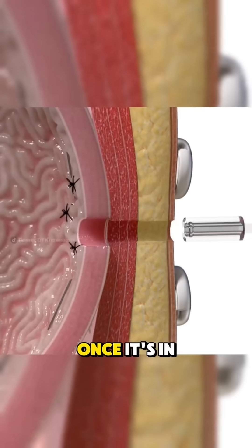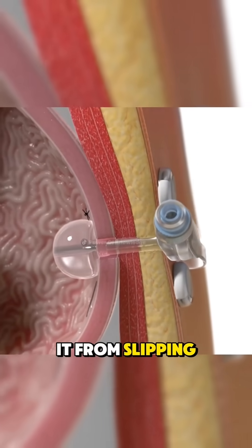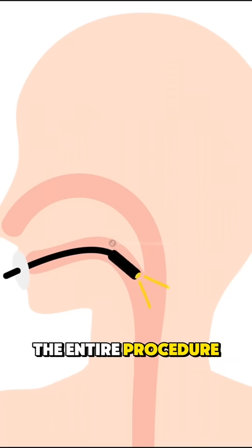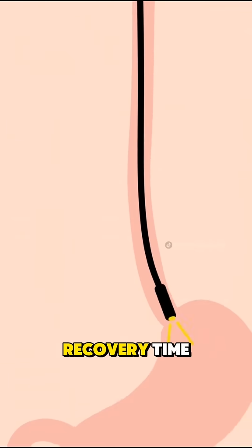The G-tube is passed through a small cut made in the skin over the belly into the stomach. Once it's in place, the tube is secured and a small balloon or bumper keeps it from slipping out. The entire procedure usually takes less than an hour and can be done with minimal recovery time.